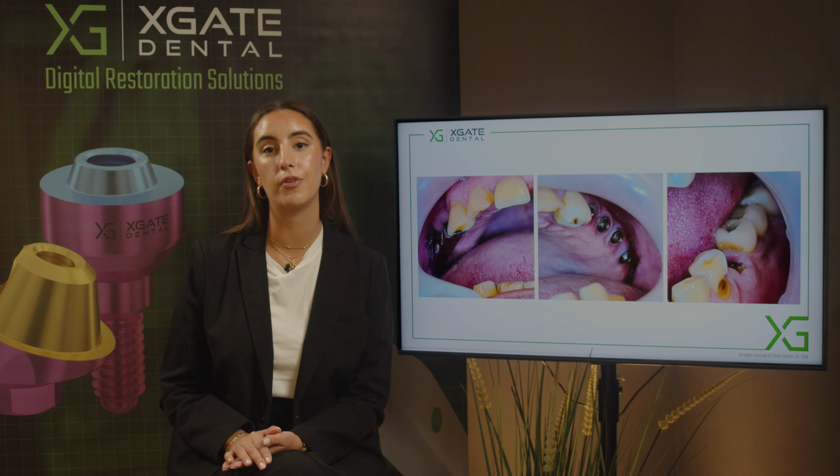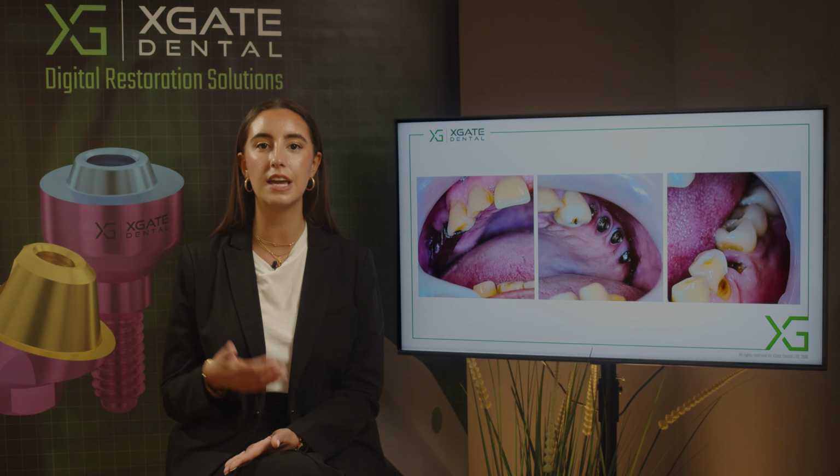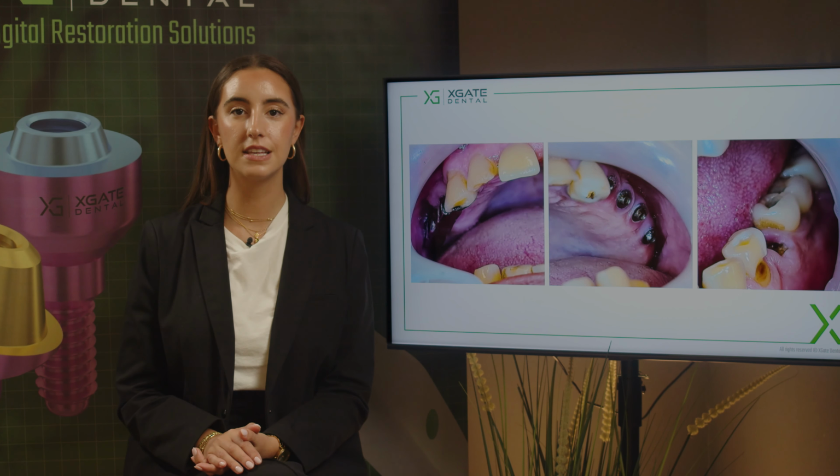We don't need to add implants, and we want to use all of the implants that we already have. But in this case, the implants were very close to one another. So we had a little bit of an issue. We couldn't even take impressions. We couldn't fit the scan abutments on both of the implants at the same time. So this is what we want to show you today.